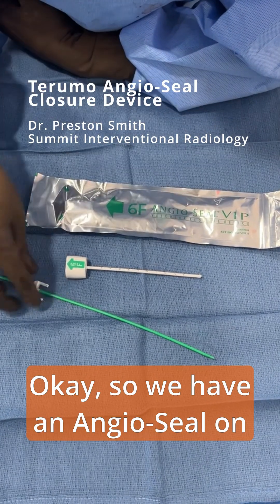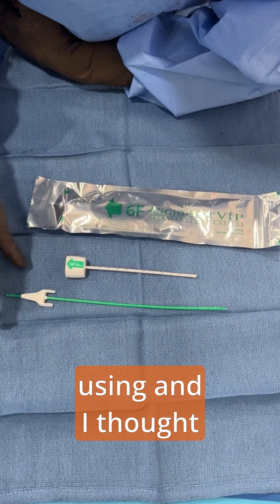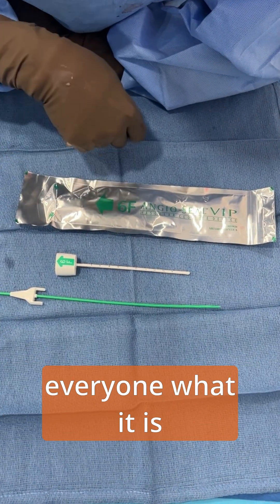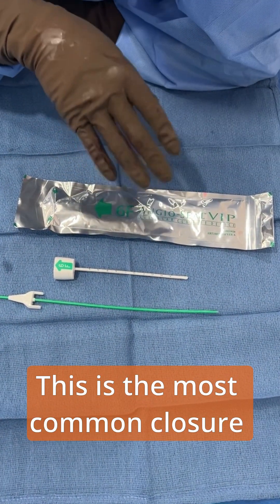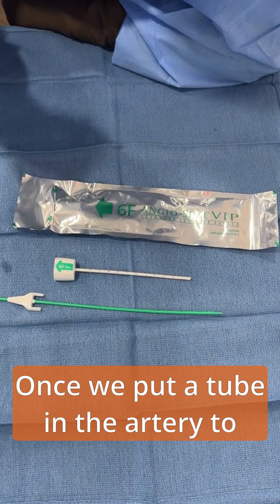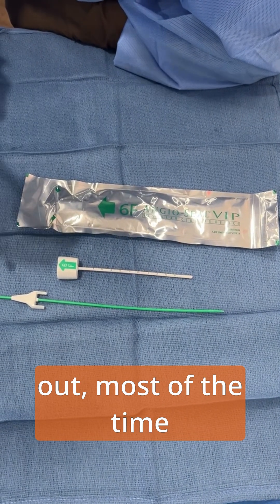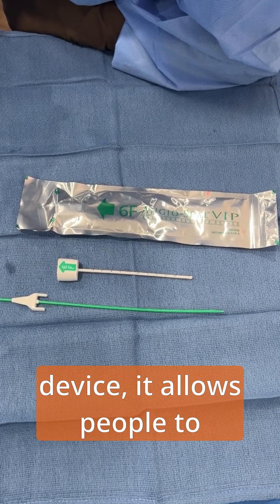We have an angioseal on the table here that we ended up not using, and I thought this would be a good time to show everyone what it is. This is the most common closure device that we use for patients. Once we put a tube in the artery to do a procedure and then pull it out, most of the time we put in some sort of closure device.